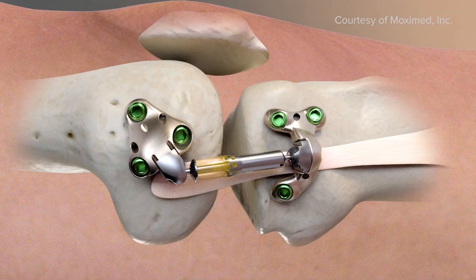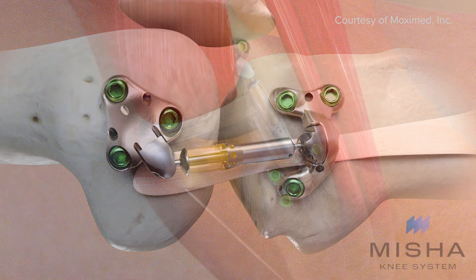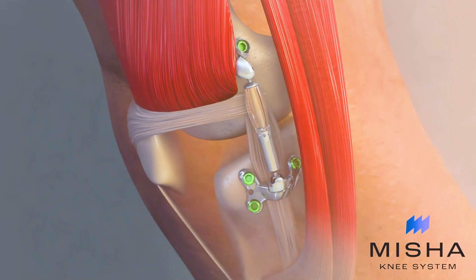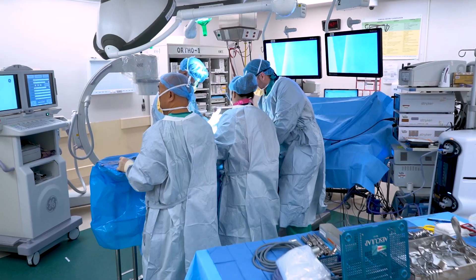It's made out of metal and a polyurethane plastic. The metal pieces — one attaches to your femur, which is your thigh bone, and one attaches to the tibia, which is your leg bone. What's in between is the actual shock absorber. One part pistons into the other, and that top part is made out of polyurethane. It's almost like squeezing a marshmallow and then it kind of pops up — it's a shock absorber.